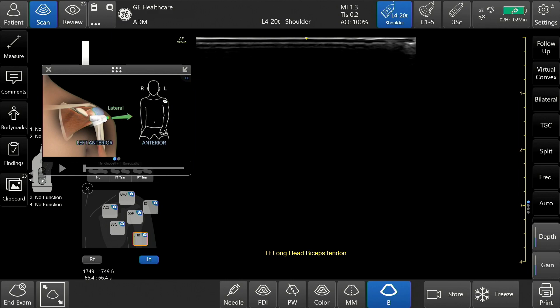Shoulder Diagram is a tool that is meant to aid the user during a shoulder assessment by allowing the user to document findings and assign them to specific anatomical zones on the left or right shoulder. The diagram contains a left and right side that the user can swipe between.